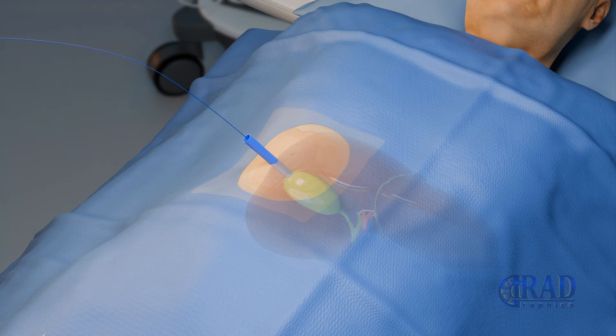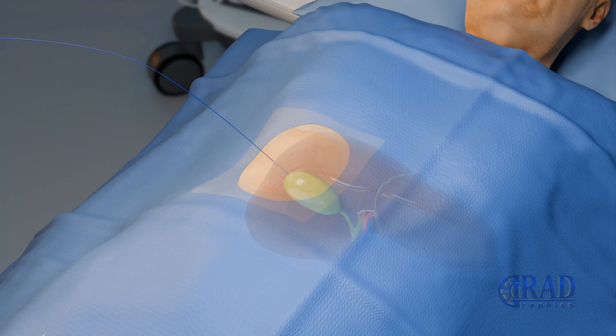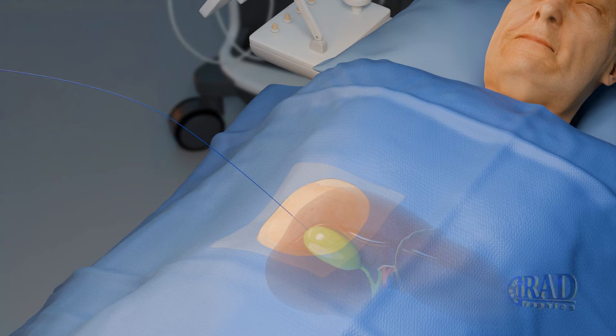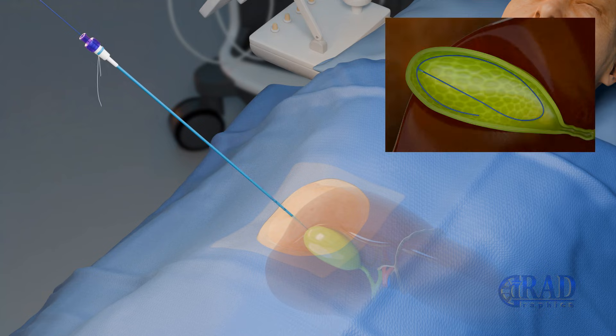After the procedure, the Nephromax tube is removed. Then, a pigtail drain is placed within the gallbladder.